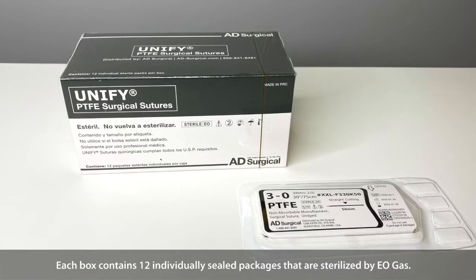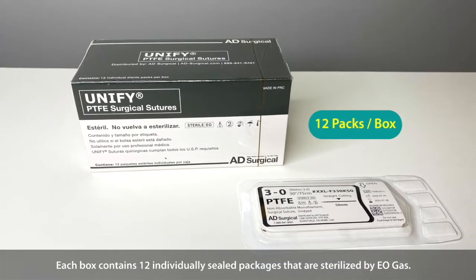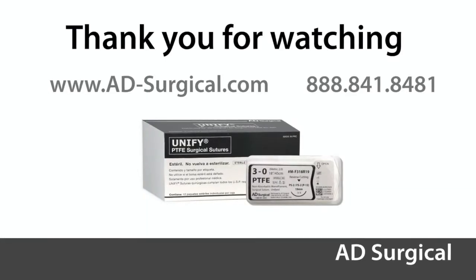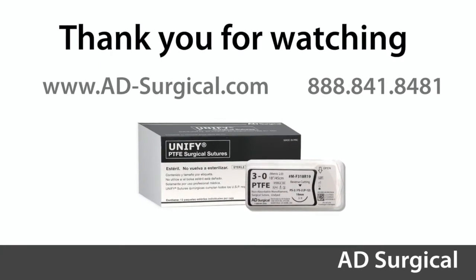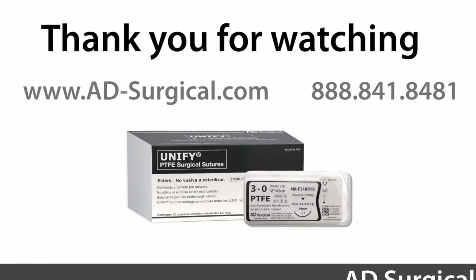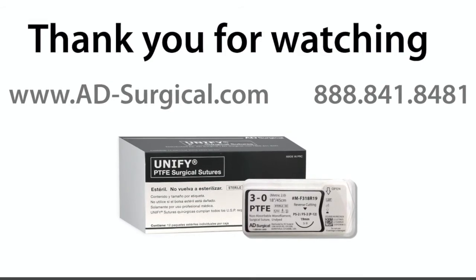Each box contains 12 individually sealed packages that are sterilized by Eogas. For more information, visit www.ad-surgical.com or call 888-841-8481.